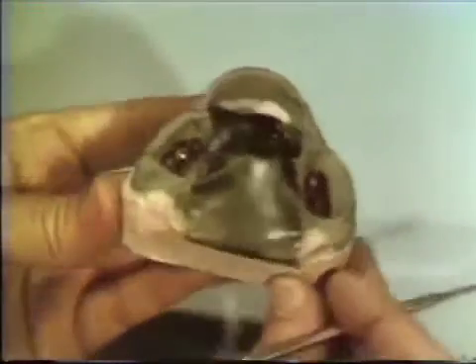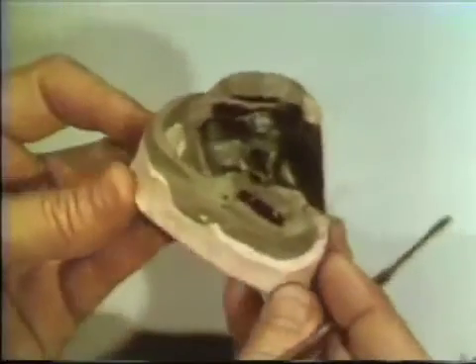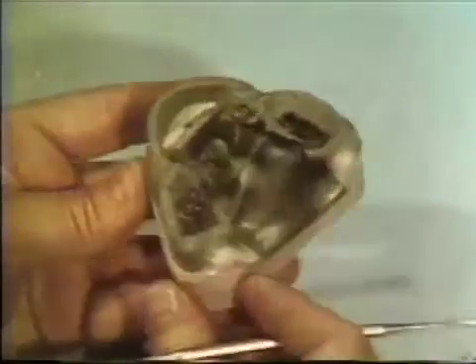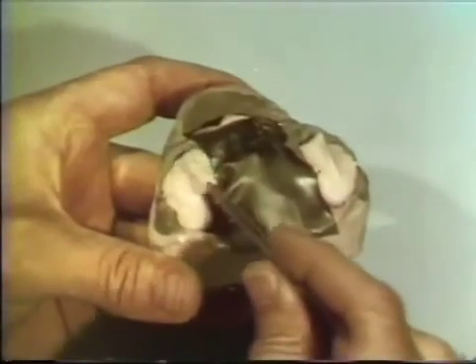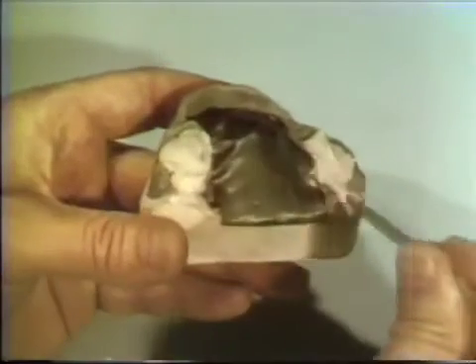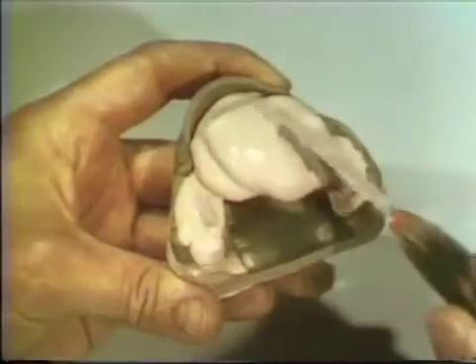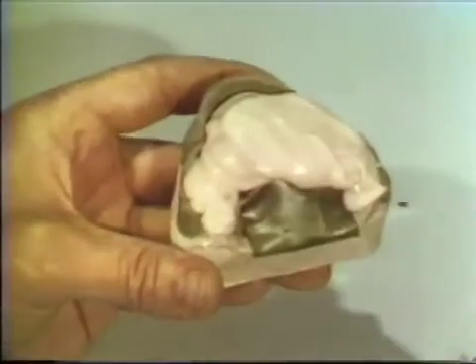Separating film is placed on the occlusal stops before the stone mix for the occlusal template is applied. The first segment of stone is carefully worked into the occlusal stops. A dye-type improved stone is used to reduce the possibility of abrasion, as any alteration of the template would result in occlusal inaccuracies. Larger portions of stone are used to bridge the tongue space.